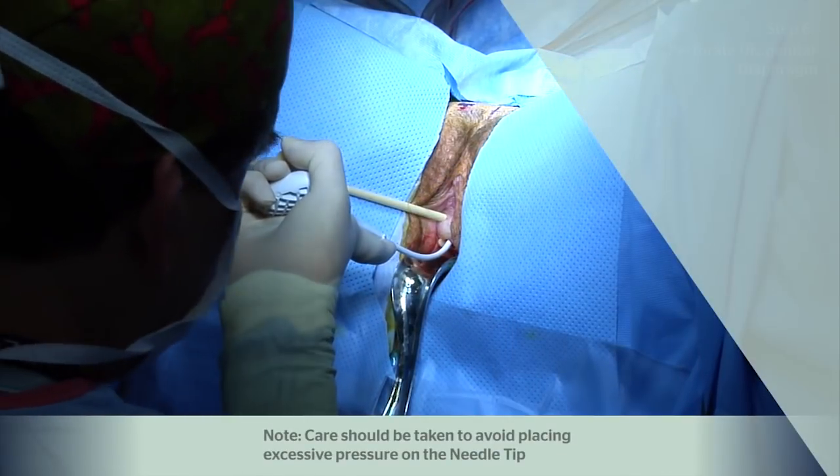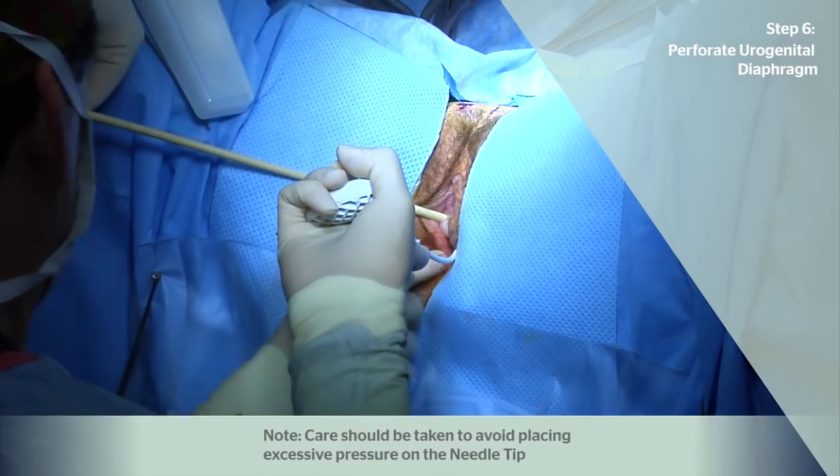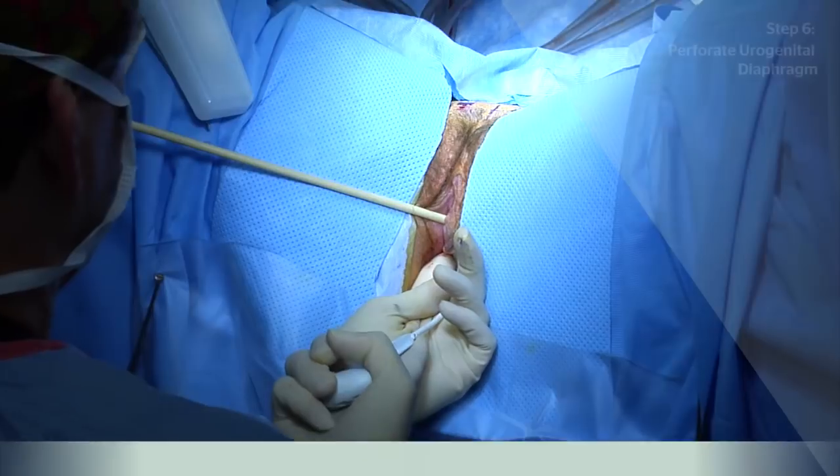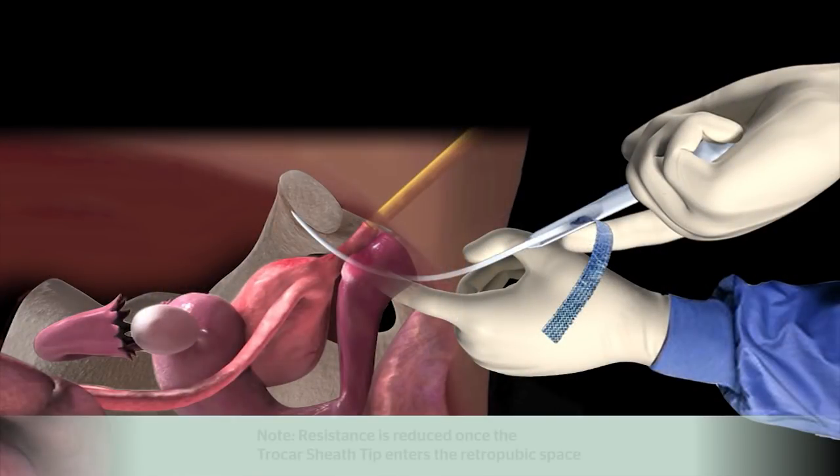During perforation of the urogenital diaphragm, lower the trocar handle to ensure that the trocar sheath tip passes vertically while staying in close contact with the back of the pubic symphysis. Pass the tip of the trocar sheath until it has reached the end of the dissected space.